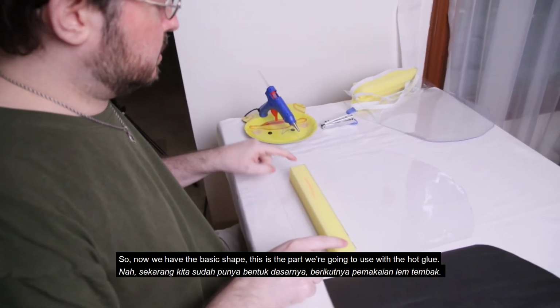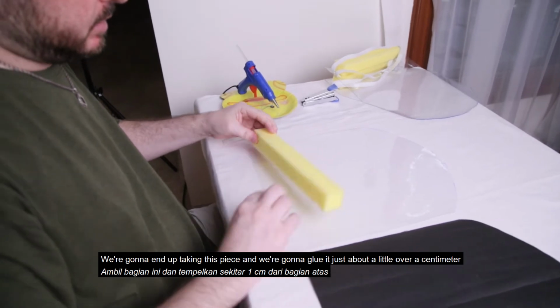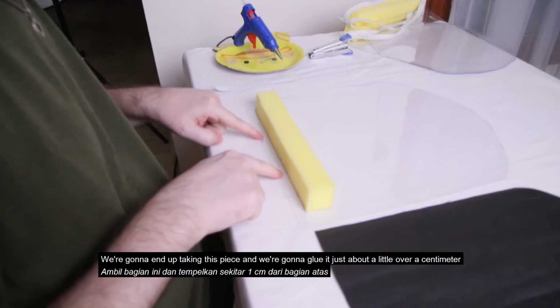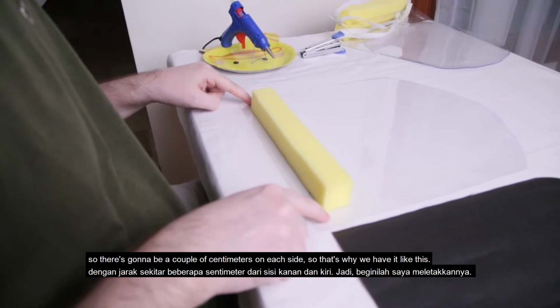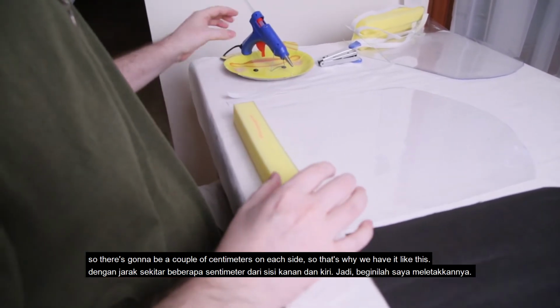This is the part that we're going to use with the hot glue. We're going to end up taking this piece and gluing it a little over 1 centimeter from the top, what will be the top of the face mask, and right in the center. So there's going to be a couple of centimeters on each side. So that's why I have it like this.